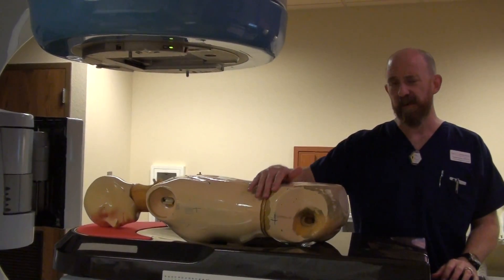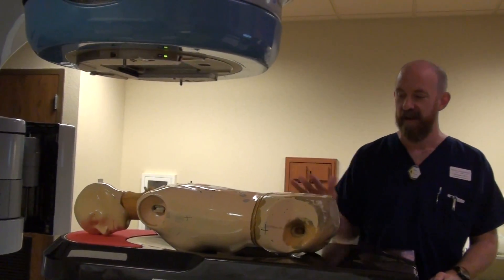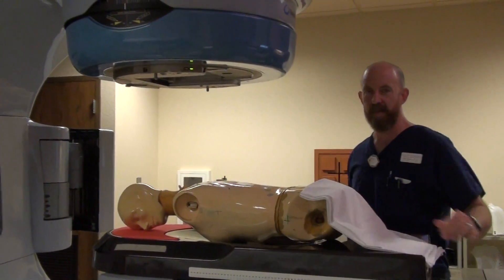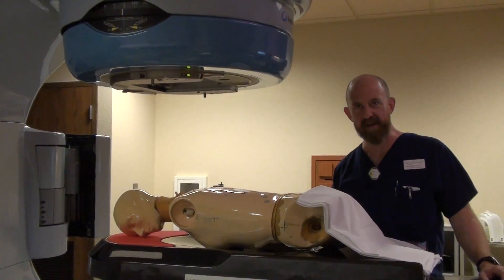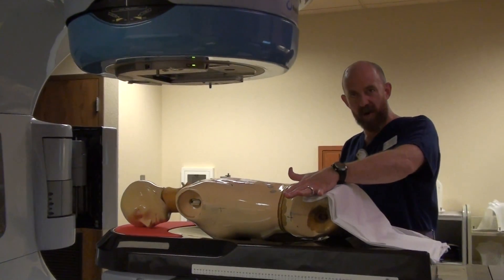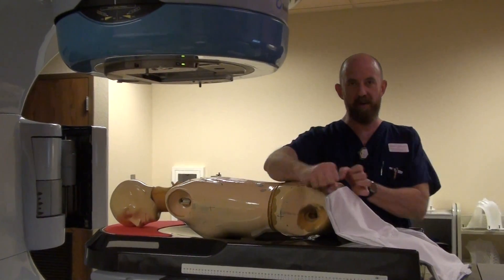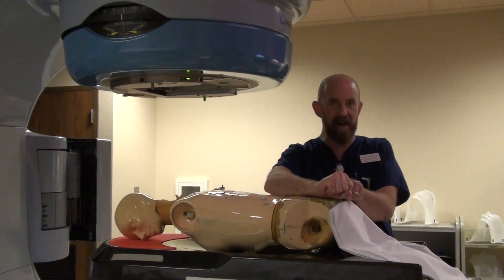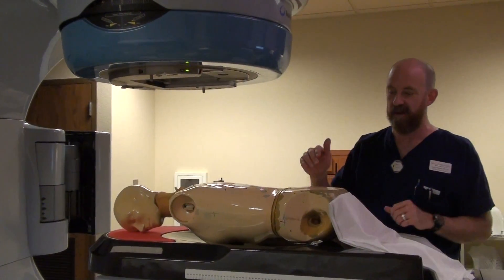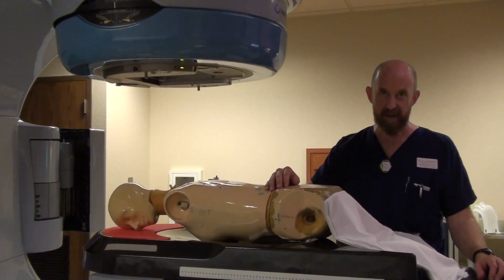This is the most difficult treatment to set up and be reproducible because the patient feels vulnerable. We're going to line them up — they're face down, everyone else's faces are at their posterior, and you're actually grabbing them and rolling them. What they tend to do is tighten their gluteus muscles up and squeeze their hips together. That's going to move your marks. So when you know that your patient has tightened up, you're going to have to try to get them to relax, which is difficult.